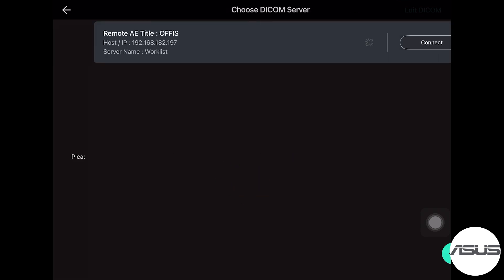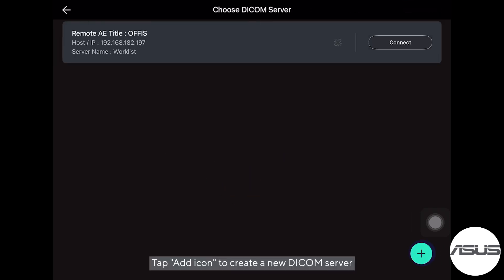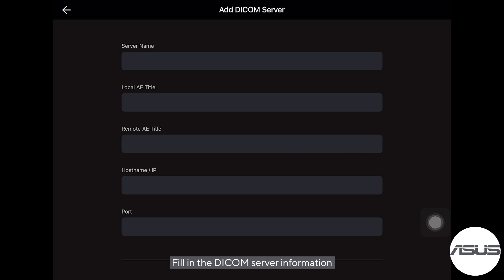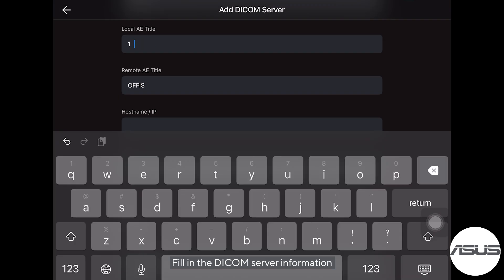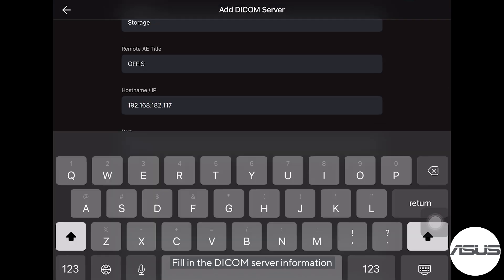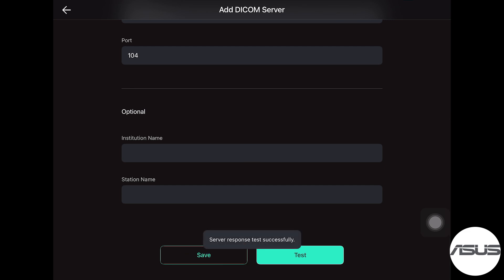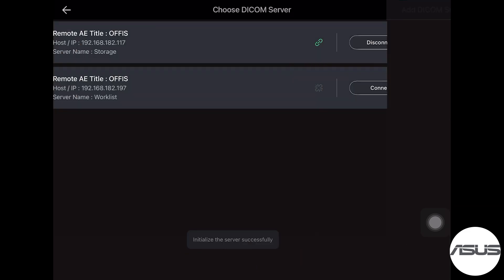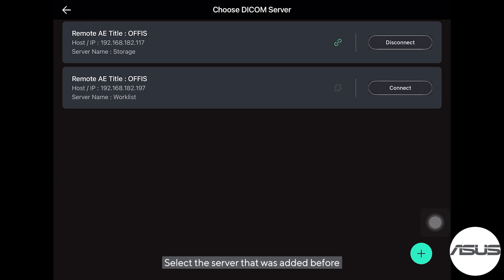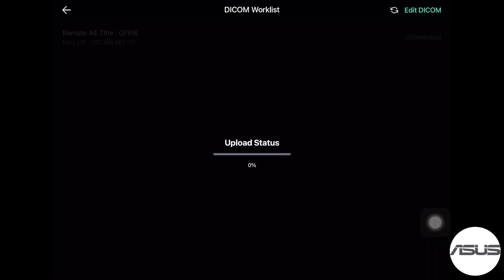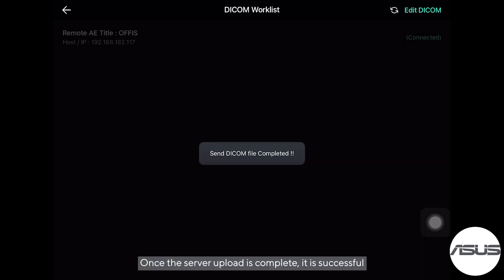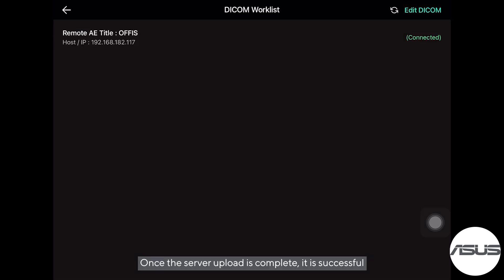Tap the DICOM button to connect the server. Tap the IT icon to create a new DICOM server and fill in the DICOM server information. Tap Save. Select the server that was added before. Once the server upload is complete, click the Search button to confirm it is successful.